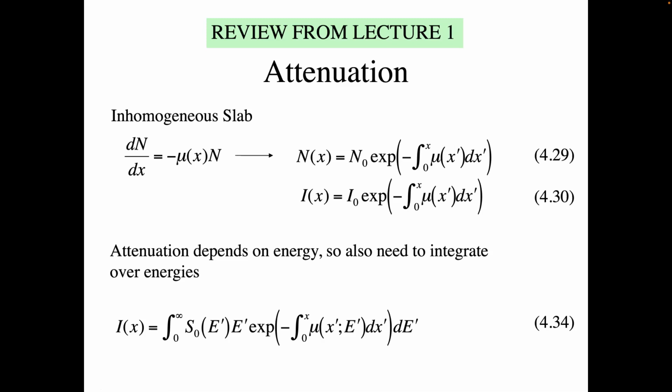So this function, in one dimension here, this is going to be our image. It's like, what is mu as a function of position? What's the linear attenuation coefficient as a function of position in my object? That's what we're going to figure out, right? If you wanted to do this absolutely precisely correct, and there are ways of doing image reconstruction in which this is all taken into account, the problem with them is they take a long time to compute, right?